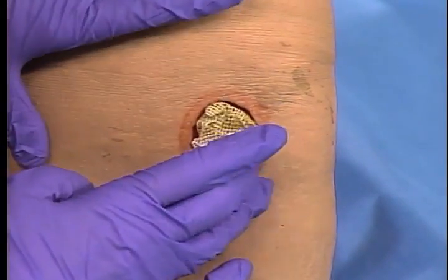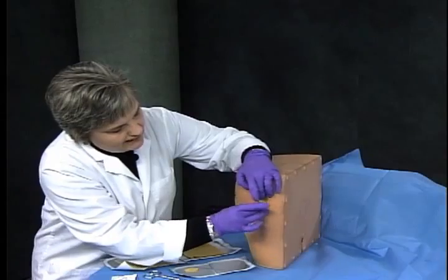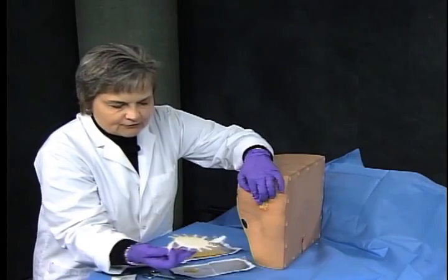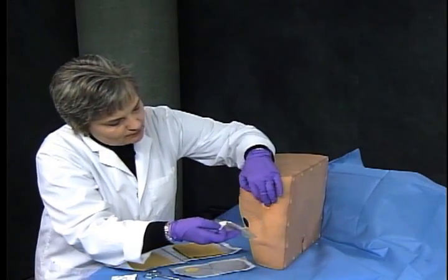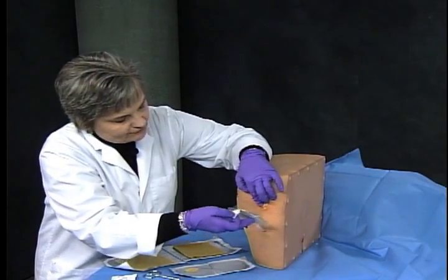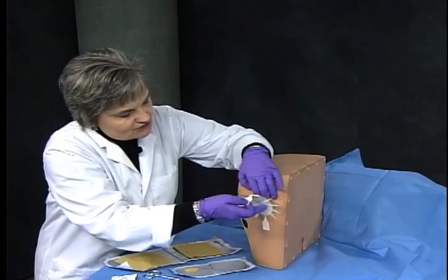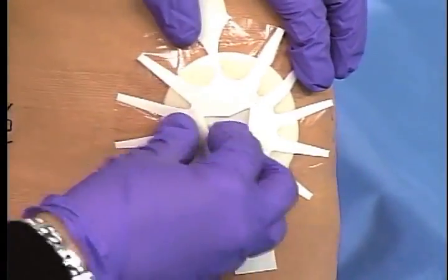And then, at that point in time, you are ready to put on your cover dressing, and with our Tegaderm foam adhesive dressings, it's actually nice because they have very large tabs on. So normally you'd be able to do this obviously with 2 hands because your patient would be laying on their side. So what I'm going to do is I'm just going to gently place that dressing up over like so, press it down in place.